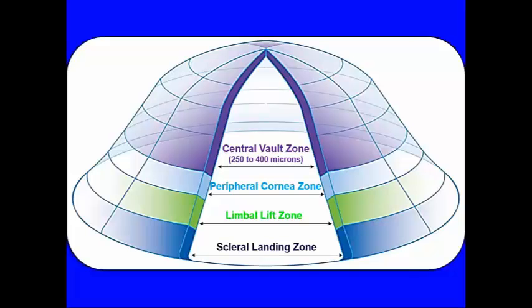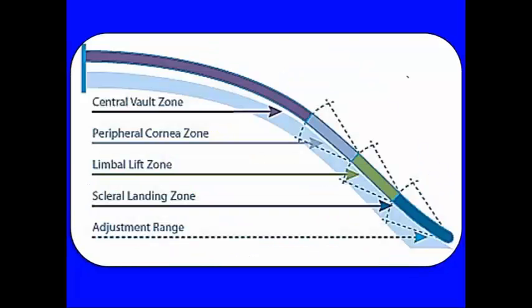We believe that the third zone is instrumental in making a modern scleral lens perform well, and that is that the design clear the limbal area. The limbal area where the stem cells lie, we feel is an important area on which we try to avoid excessive pressure and bearing. Finally, the lens needs to land somewhere, and that is in the area of the scleral landing zone. So those become the 4 ingredients, components on the back of the Ampleye design.